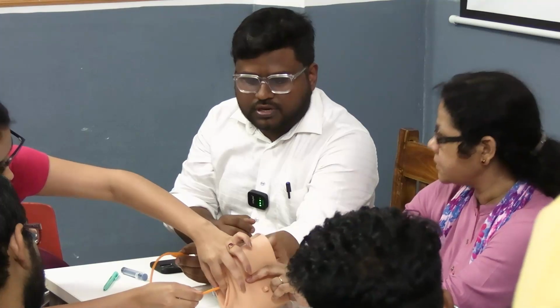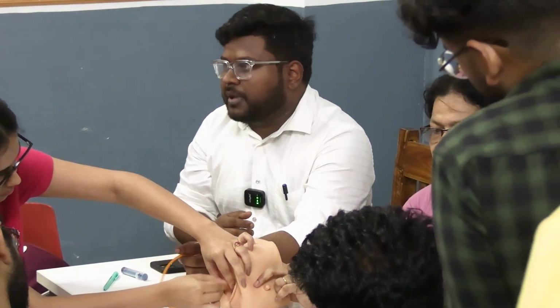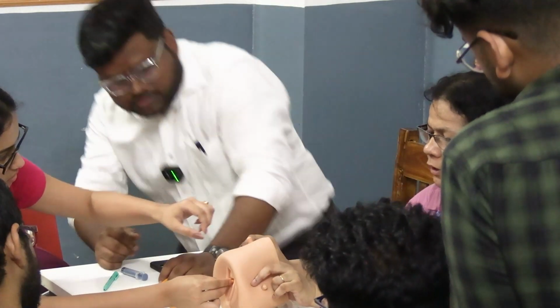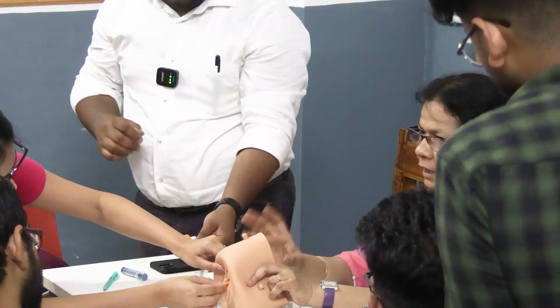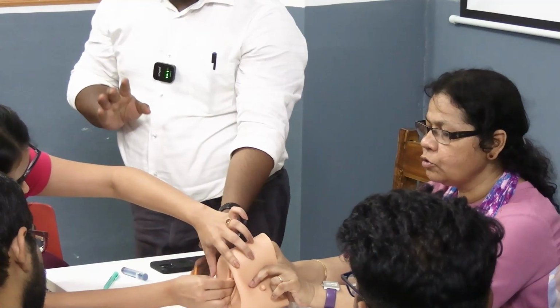Take it out from the back. Yes. Then perfect. You have to demonstrate that, how you take it out of the sterile bag and how you put it in. Further, that balloon should go inside. Ideally, you have to put it in at least up to the middle part of the Foley's catheter. You push it in.